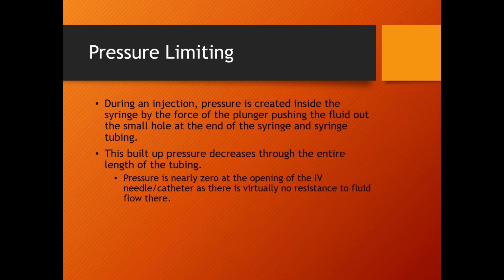Whatever max pressure we have in the syringe here, by the time it gets out to this little tiny tube right here, we're getting single-digit pressures again. It's just we don't want these to explode during the actual injection. So what pressure limiting is, let's say we do our injection, flow rate of 5, volume of 50, pressure limit 300 PSI. And for whatever reason, during the actual injection, the system is monitoring how much pressure is in each syringe. If it senses that we have hit the pressure limit, if we hit 300 PSI, anybody have a guess? What does the injector do?